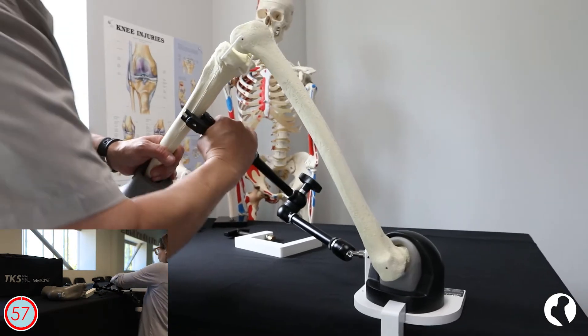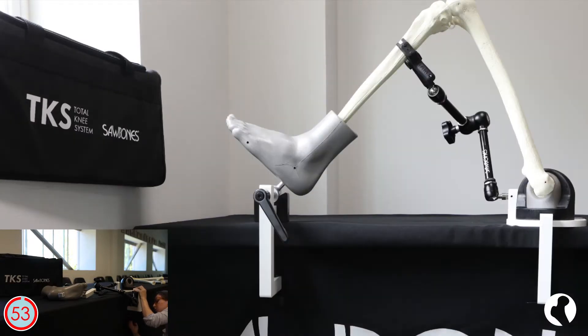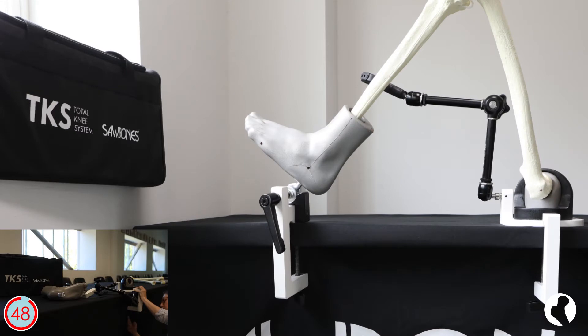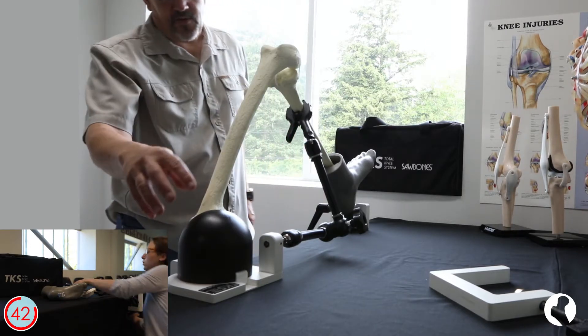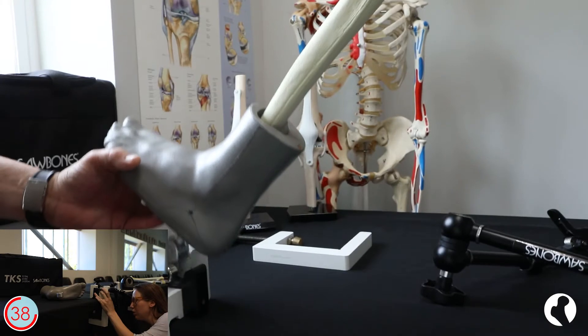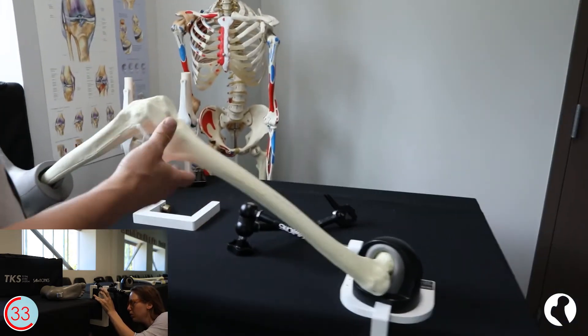The new model features an upgraded foot and pelvis clamp and an upgraded multi-position bone clamp with increased range of motion. These improvements allow for a more stable setup, resulting in less vibration with oscillating saw cuts. The TKS also allows full hip rotation for surgical navigation.